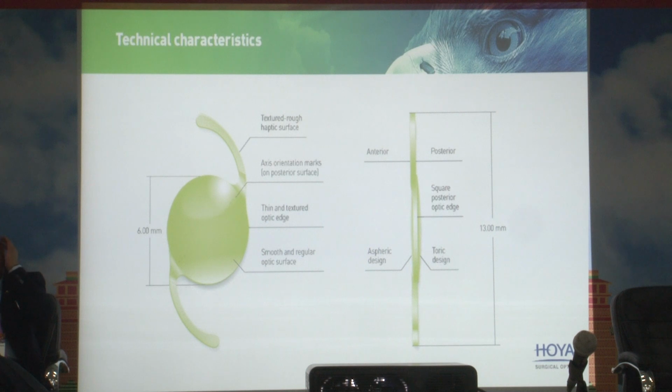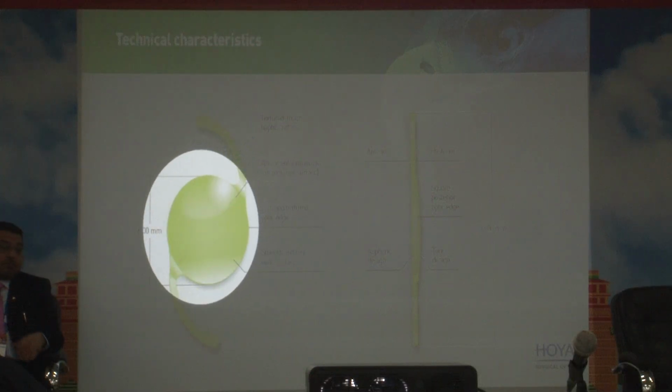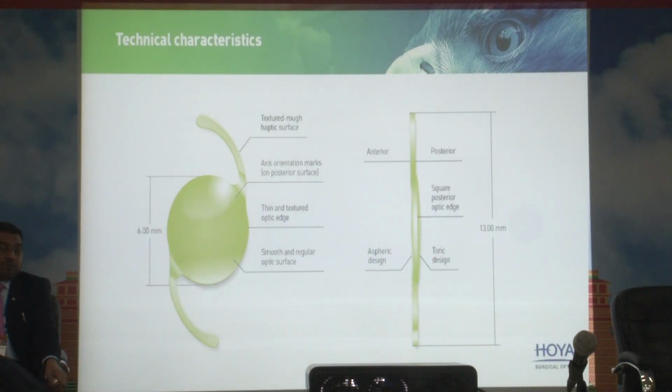It's not anything hugely different from what we have already seen thus far, but the only thing that changes is the textured rough haptic surface out here. And then the alignment holes. The alignment holes on the optic surface are very prominent and big. They sometimes are important, particularly if you're handling a case with a small pupil and you're trying to align a toric IOL along a small pupil. These very prominent deep holes actually help you see the holes, see the lines, and enable you to align them properly along the desired axis. So they really come in handy at certain times, not always maybe, but say in hazy cornea or small pupils, they actually help you a lot. Not a huge difference, but still it is a difference.